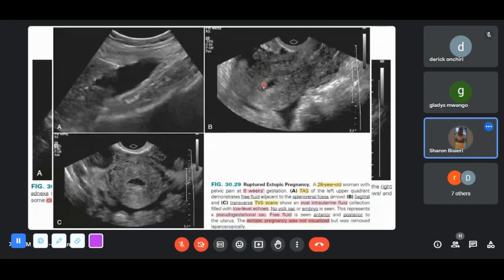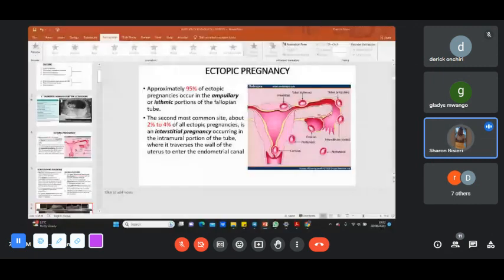And then within the endometrial cavity, we are seeing this anechoic fluid collection with internal echoes. Then anteriorly and posteriorly to it, we're seeing this anechoic collection also, but it also has internal echoes. Sorry, let me let someone in.